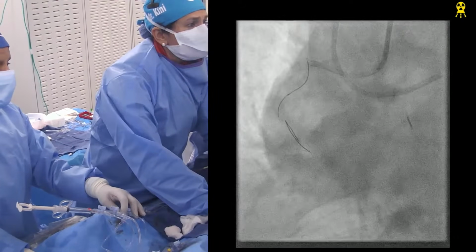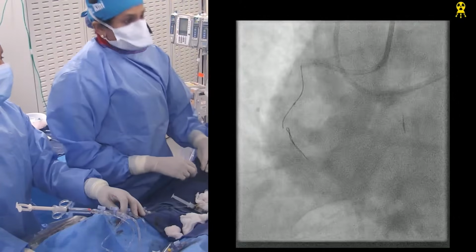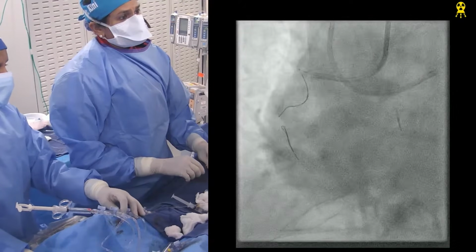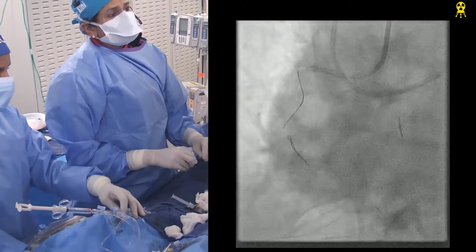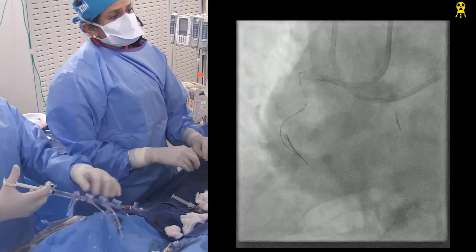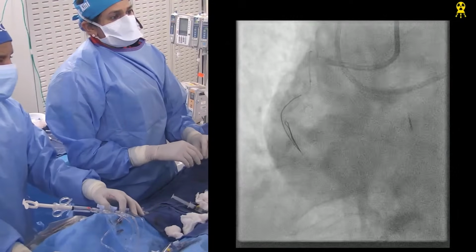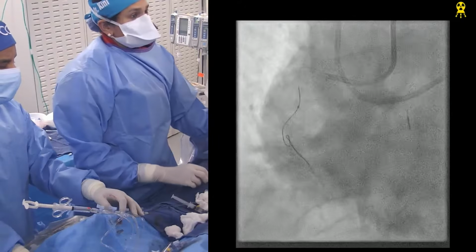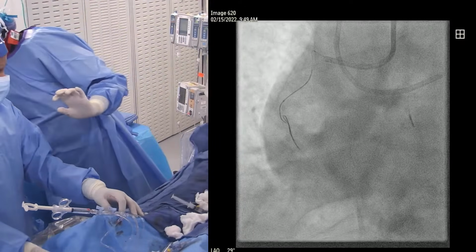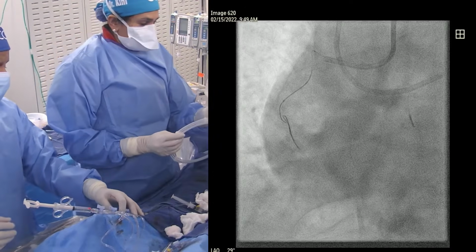That's okay. The knuckle, yeah. You want to go with the knuckle? You can push the knuckle more, but it's not going without support. Can we push the knuckle further? No, it's not going. Okay. What do you need? Progress 200.